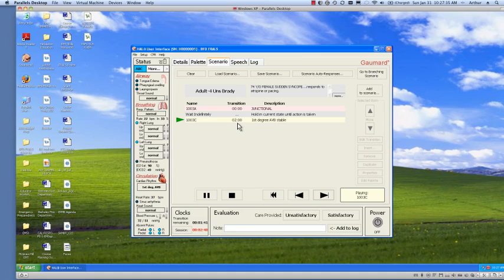So for over 2 minutes the blood pressure will rise, the heart rate will rise a little bit more realistically than just switching it over. And this will just continue to play until the end and then stay here until it's done. So that's how this one works, and all the other ones are very similar to that.